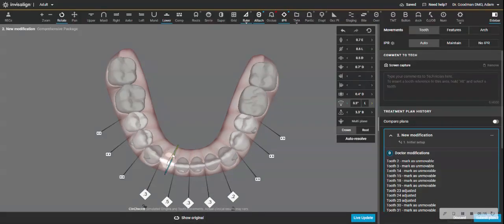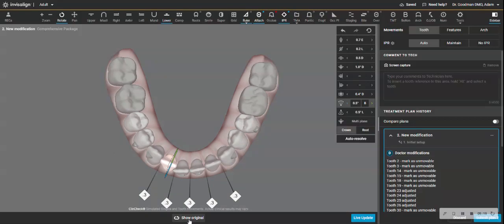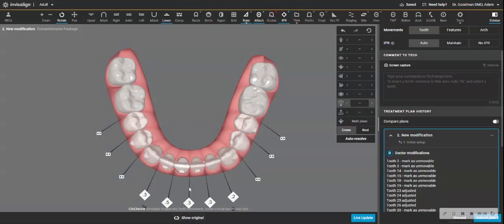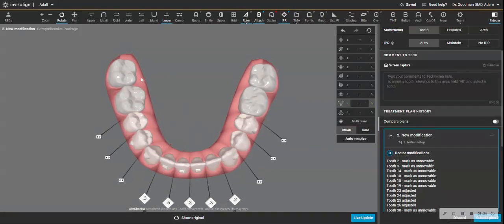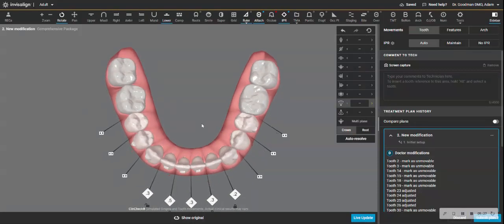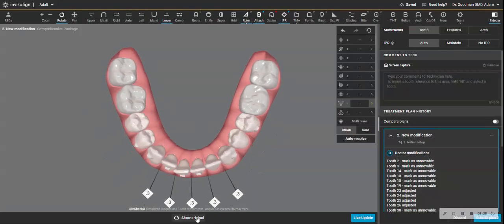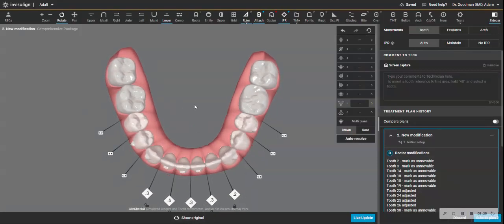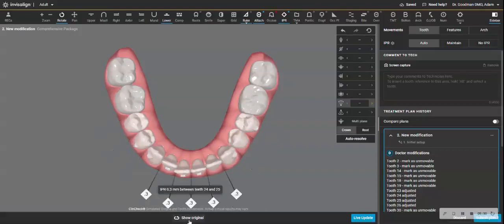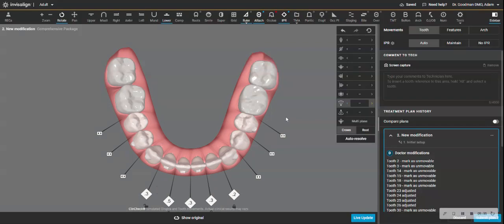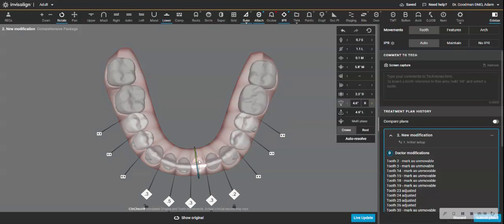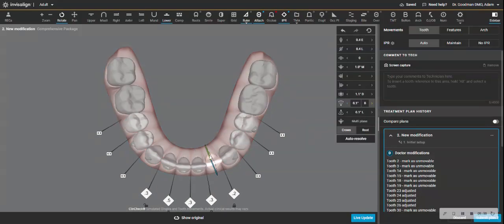Because we're not moving the teeth a long distance. So why not let it move without the torque? Because when you're putting torque on that tooth, when you don't really have to—remember, this is not an extraction case, obviously—there's going to be more side effect to those back teeth. This is one of the reasons why I don't have a lot of posterior open bites.